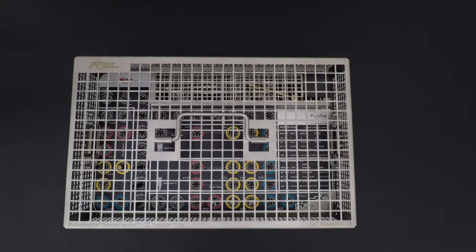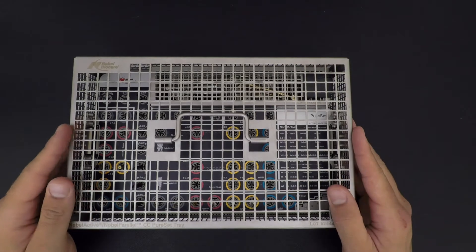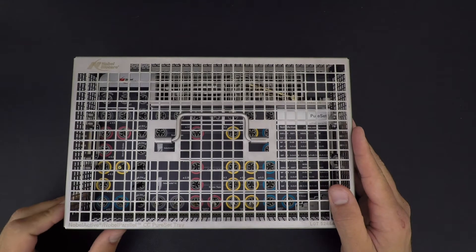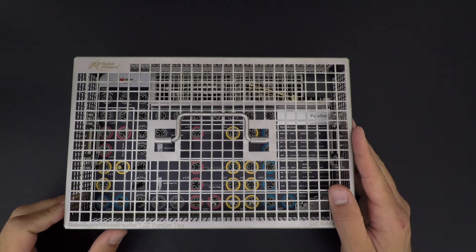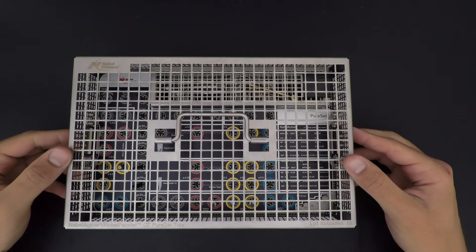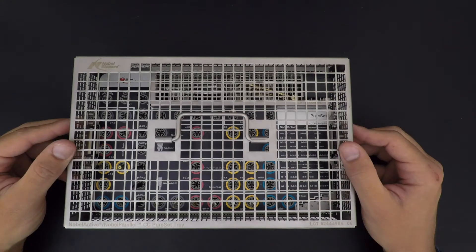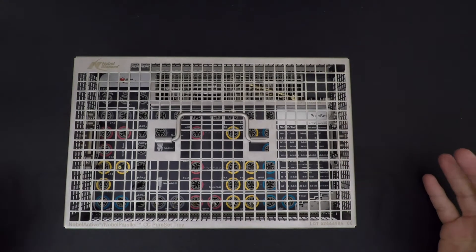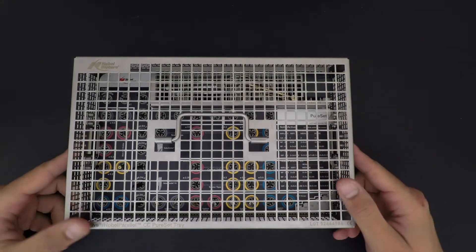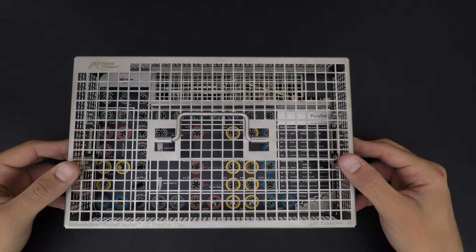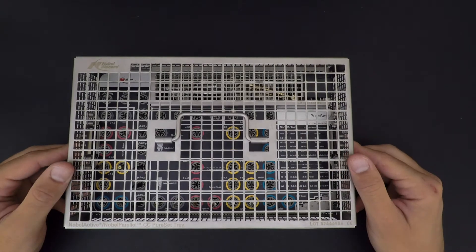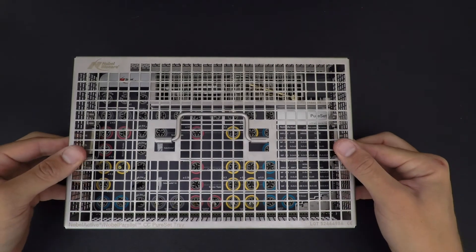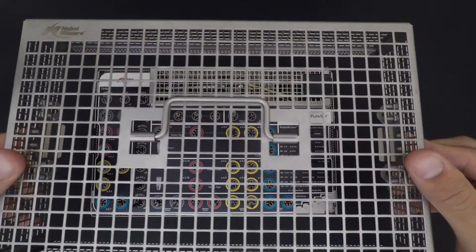This is the Noble Active and Noble Parallel CC Pure Set. To open it, it's pretty simple - you have to press on both sides of the tray and lift it up.